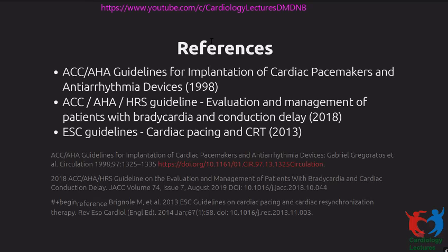So there have been studies done on this where they implanted a loop recorder in these patients, which is a good strategy too. You can implant a loop recorder, and what you find in these patients is that most of them, when they come back with syncope, the cause is heart block.